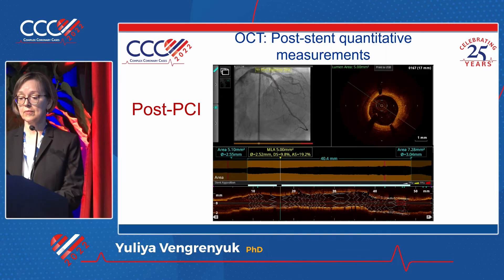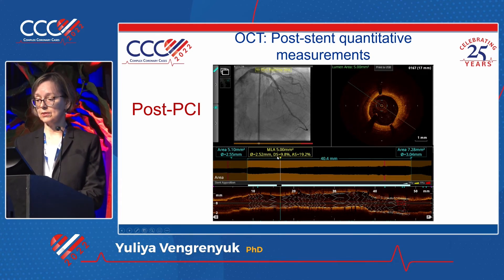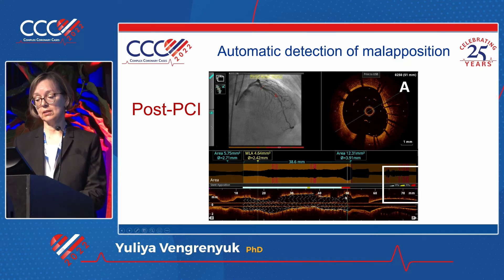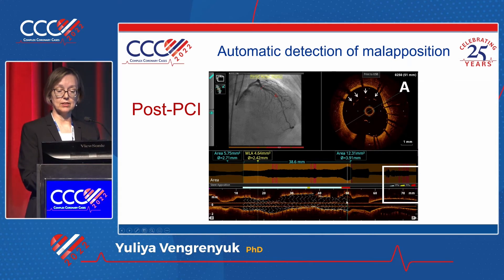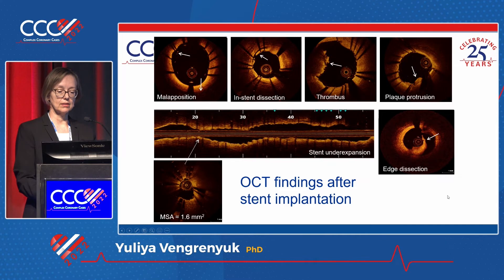The same applies for post-stent assessment: stent expansion, minimal stent area — everything is co-registered with angiography. There is also a very convenient tool for stent reconstruction which automatically detects malapposed areas. Red struts in the longitudinal view correspond to malapposed struts in the cross-section view. Post-stenting OCT can show many features including stent dissection, thrombus, plaque protrusion, edge dissection, and minimum stent area.